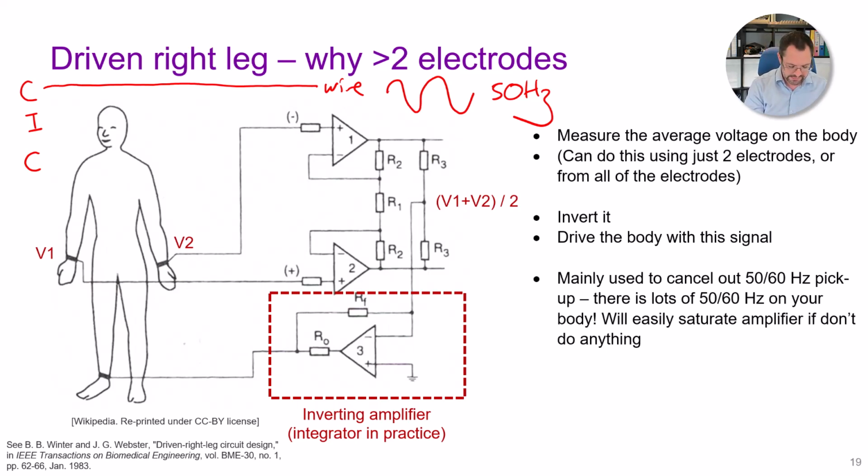If you remember some of your electronics courses, that is a capacitor. A capacitor is when we've got conductor, insulator, conductor. And so although there's no direct connection, there is this kind of wireless connection between you and the 50 Hertz that is powering all of the electronics that we have.